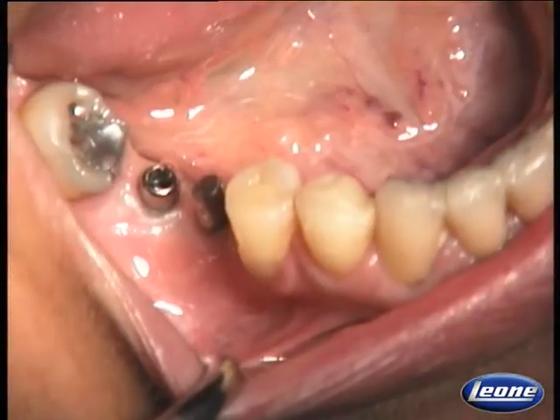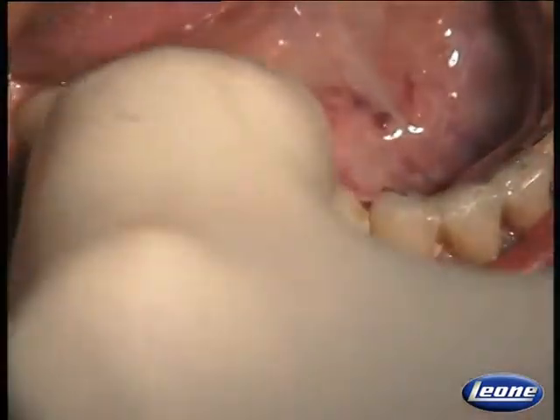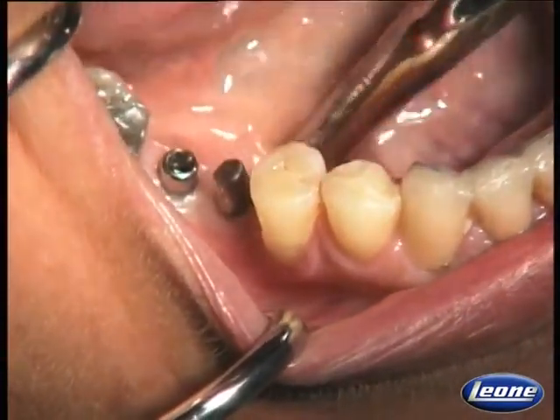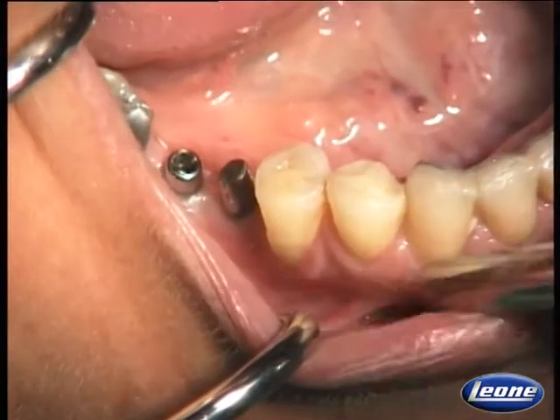There are only a few microns of difference between the abutment's position pushed down with finger pressure and its position after having applied an impulsive force with an abutment beater.